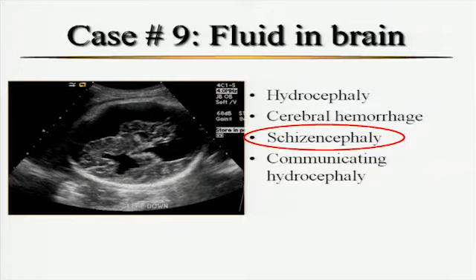So when you see the dilated ventricles, make sure, even though it's a pain to try to get the ventricle that's closest to the skull, that's closest to the transducer, angle around, you need to be able to see both of those ventricles. Don't just go by one. That one side was down and they never saw this other abnormality. So totally different prognosis for this child.